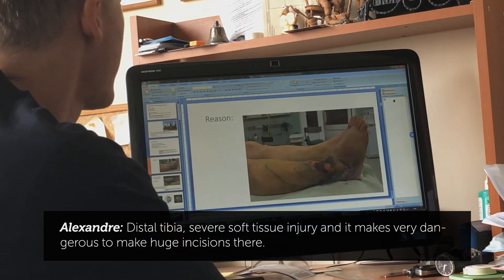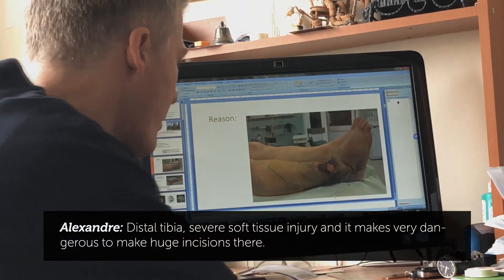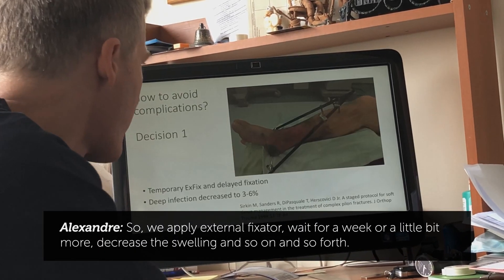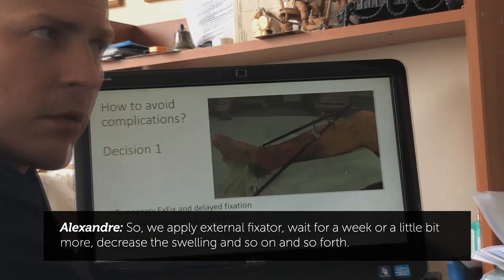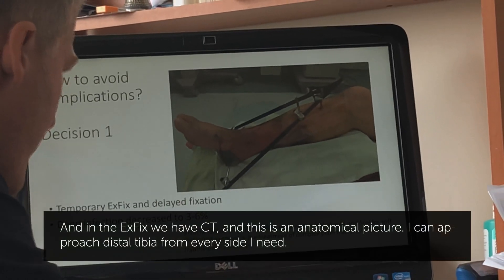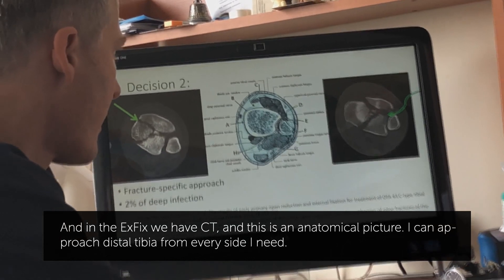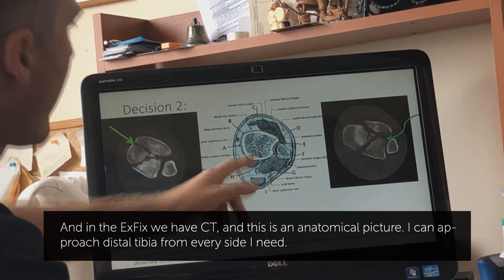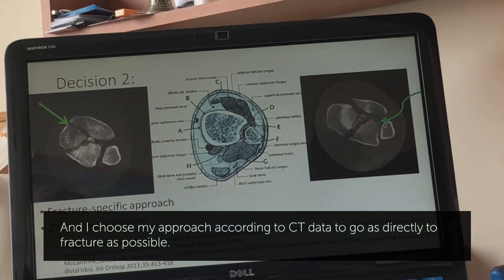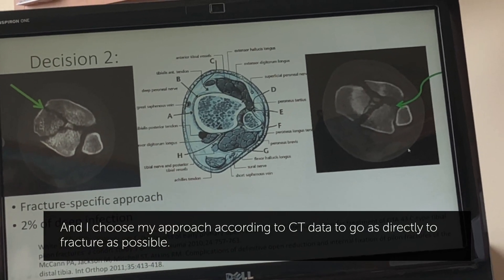Here is a case example: a pilon tibia fracture with severe soft tissue injury. It is very dangerous to make a large incision immediately, so we apply an external fixator, wait for a week or a little more to decrease swelling. In the external fixator, we perform a CT scan, and this gives us an anatomical picture. I can approach the distal tibia from every side I need, choosing the approach according to CT data to go as directly to the fracture line as possible.